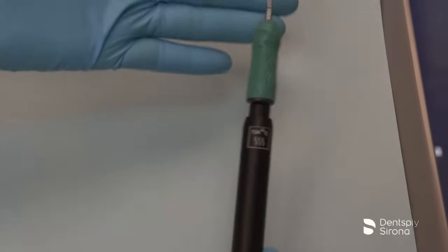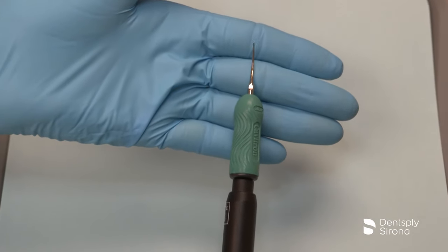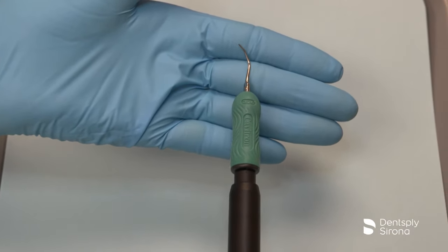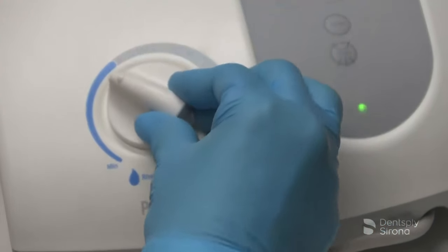This is the Cavitron FSI Slimline 1000. This insert combines a slim tip with a triple bend design with beveled edges, allowing for better adaptation around line angles, and can be used at all power levels.